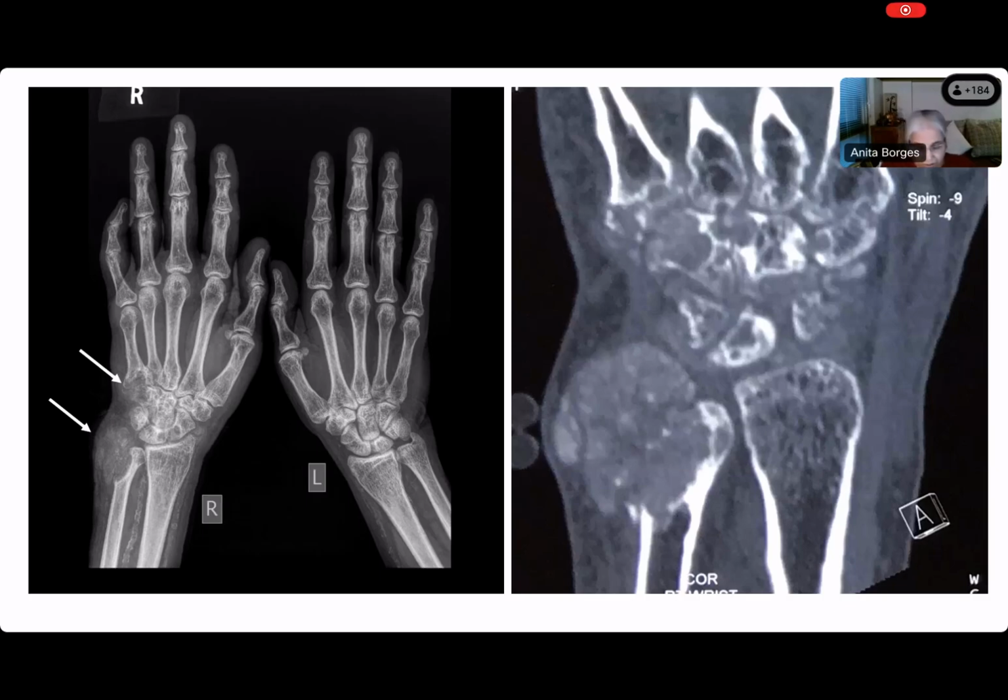Now we are not trying to read an MR or a CT, whatever the case may be. But can you tell me something, Mansi, about what you're seeing on the left-hand side? Because all of us are very happy to look at plain X-rays. Come on, Mansi, can you read that plain X-ray? On the left-hand side, the X-ray shows a lytic lesion over the distal end of ulna, which is eccentrically placed, and a similar lesion is seen in the metacarpal.